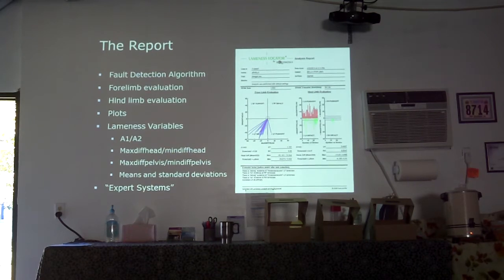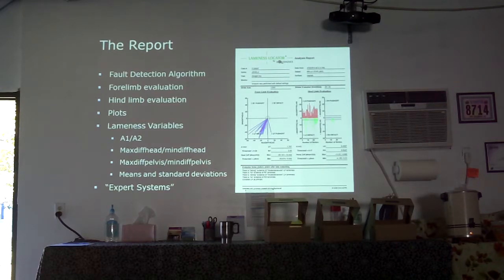Okay. Well, first the non-flat surfaces. You will find that your variation is less when you're trotting a horse over a flat surface. Your deviation is less. It's greater on a surface that is not flat. But the only reason it would really make a big difference, or that you would get a wrong result, is if it was a very consistent difference. So, for instance, let's say the horse would have to step in a hole on every right leg hit. So the surface would have to be like this, and it would step in a hole every time the right leg hit the ground. That does affect the data to a certain degree.